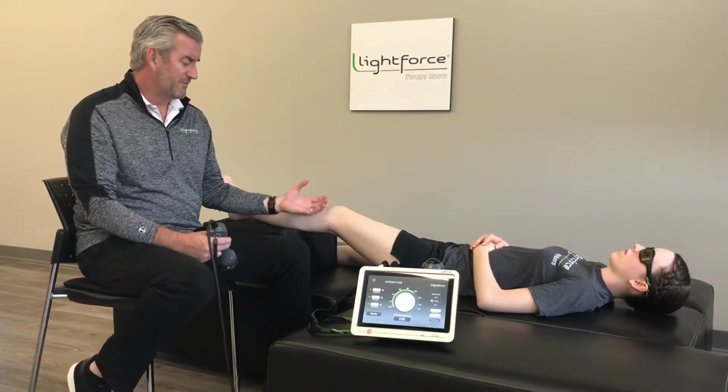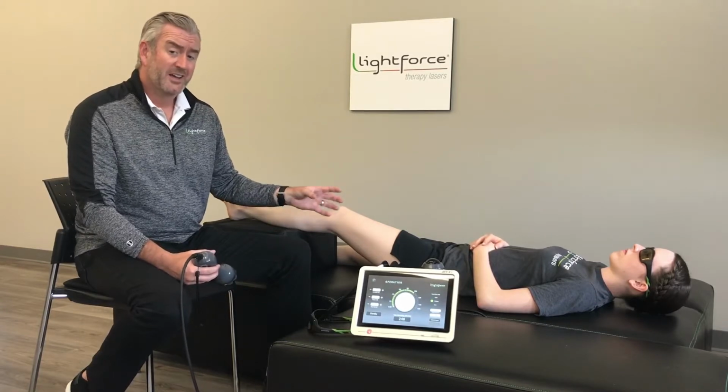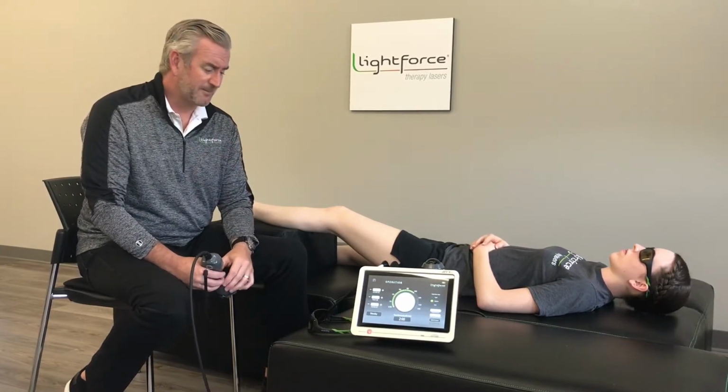For a chronic knee that isn't swollen, you're still trying to address the synovium primarily, except in that case, you're going to try to treat it with higher dose and higher power in most cases, because you're going to try to create analgesic effects and bring pain down quickly. And we'll differentiate those two things here in just a second.